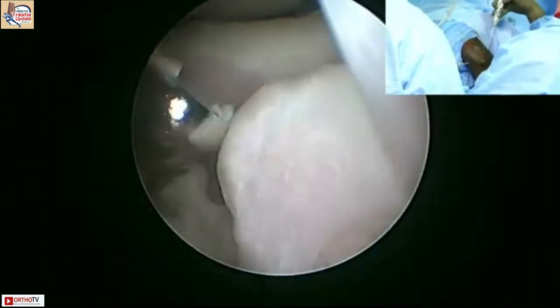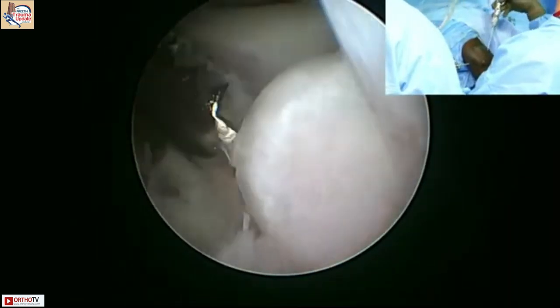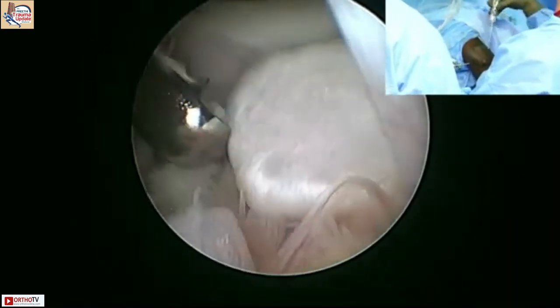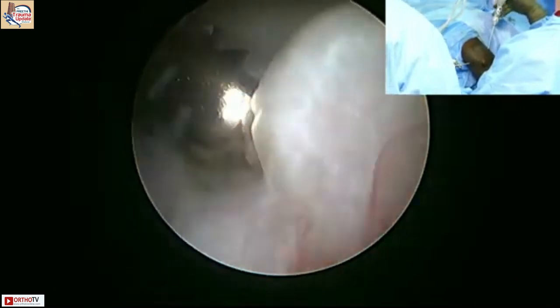Because if you stay close to the capsule, okay, so that's the loose body. Clearly visible for us. Yeah, so I will just take the base of the loose body away. Can we have the suction off? Take this off. Take the suction off.